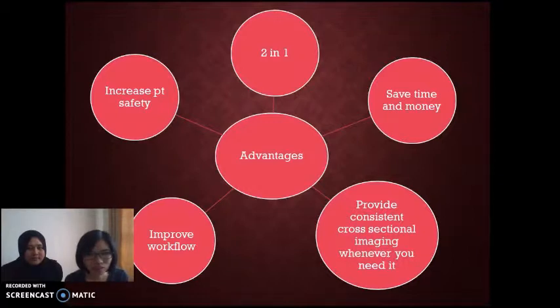Why do we say that it can increase patient safety? It is because we no need to transfer the patient from one bed to another bed. The bed can be turned 270 degrees and the CT machine can be moved in, and the table will be moved towards the CT machine or otherwise. With this kind of technology, it can increase patient safety and it provides a new technique of treatment, where the patient can be treated on the same table and no need to undergo an operation theater for surgery purposes because it becomes less invasive.